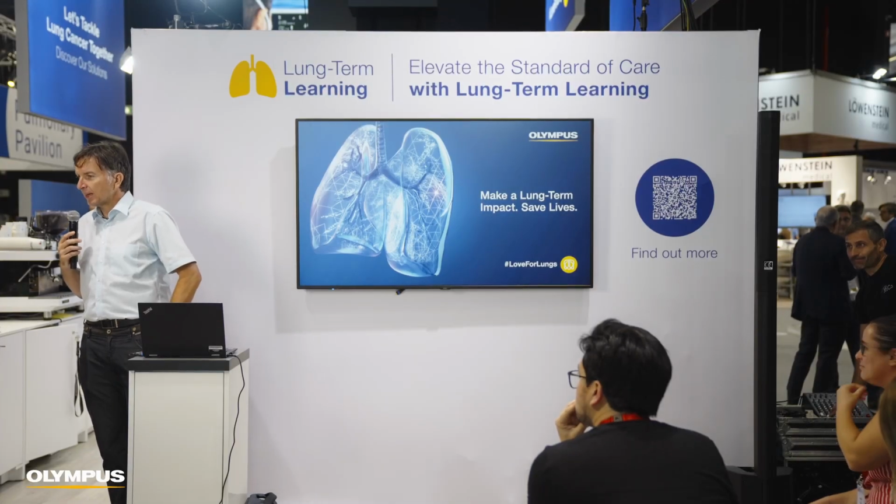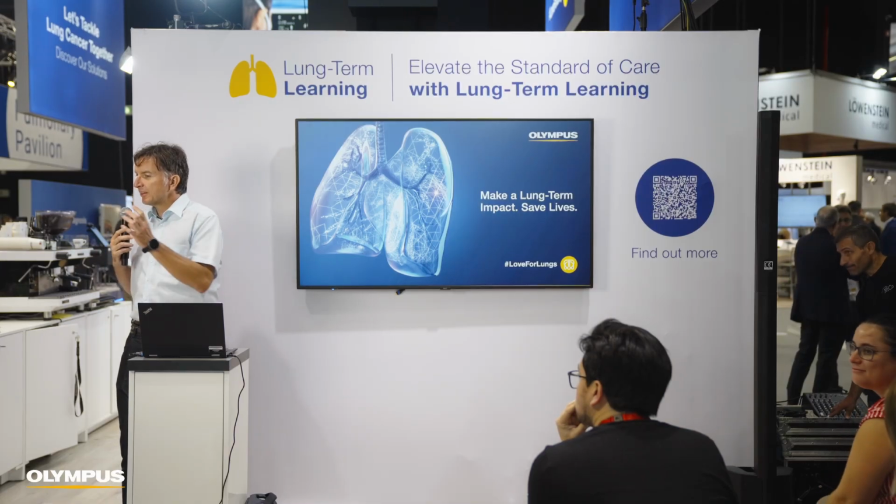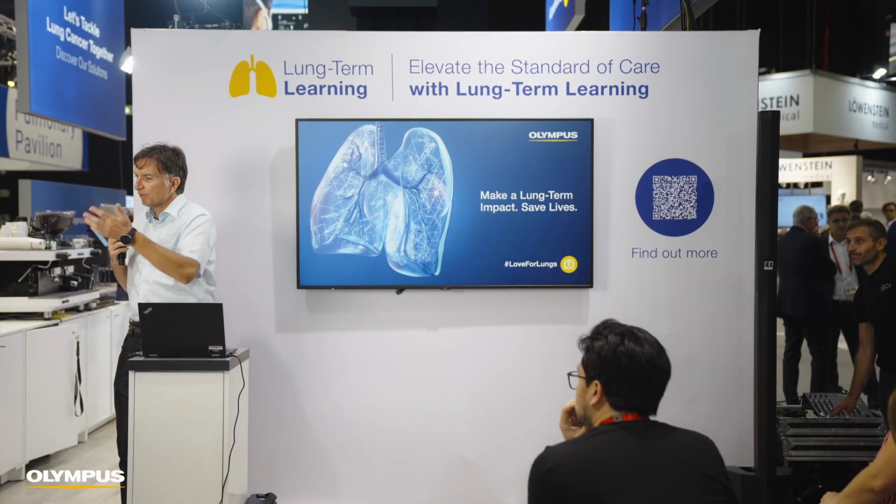Yes, sometimes you see changes after several punctures, especially if you have a necrotic lymph node. You can see the channel where the needle passes. Even with the Doppler, you can see that a small amount of blood is coming inside. So if you observe very accurately, you can see some changes in the lymph node after the puncturing, either elastographically and also with Doppler mode. Again, usually this happens in big necrotic lymph nodes.